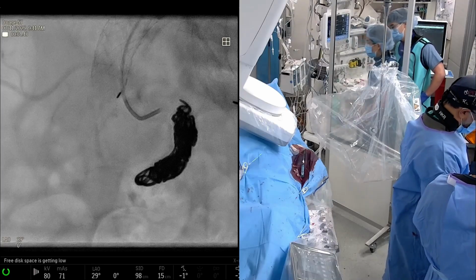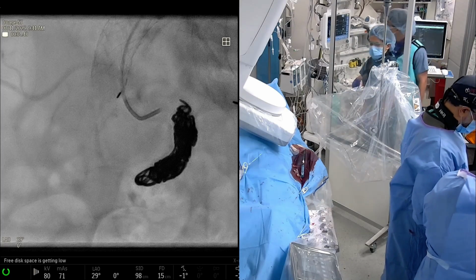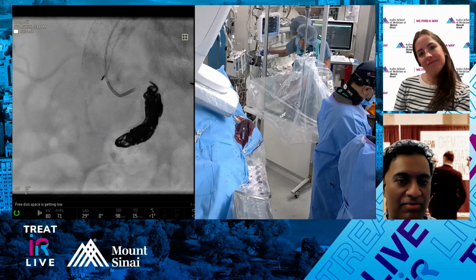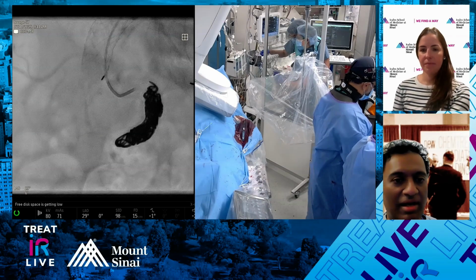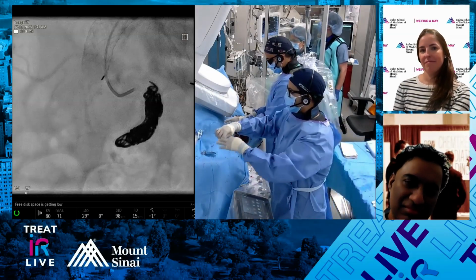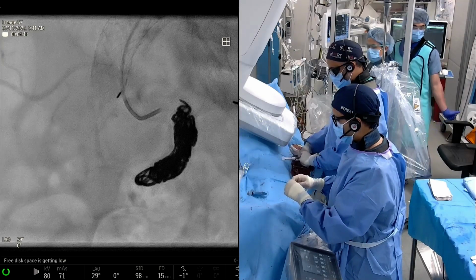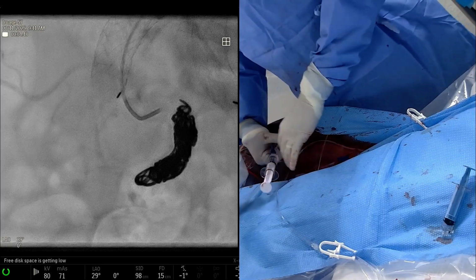For sure. Yeah, we have a lot more patients coming in either on half dose or full dose. I find these patients on anticoagulation, I don't know about low dose, but on anticoagulation for whatever reason, especially if they have a mechanical mitral or aortic valve, the INRs are really high, these endoleaks sprout. Exactly. I've had this conversation with other people about doing the angio on blood thinner, right? Because when you turn off the blood thinner, it goes away, but then you turn it back on, and it comes back. You're right. I think that's a very valid point.